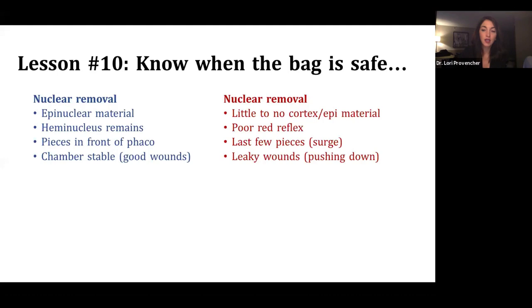During cortex removal, I think it's easy to tend to feel a little safer during cortex removal in general, but a lot of complications can come during this step. So when a lot of the cortex is still there, the bag is relatively kept back and protected, and you can feel a little safer when you have a good OVD fill. So sometimes you can remove cortex under viscoelastic, and that's a very safe, controlled way of removing cortex. And then when you have good flow, so when the bag is staying back, you're irrigating, your phaco sleeve is all the way in, and your irrigation is good, and your flow is good, that's a more safe situation.